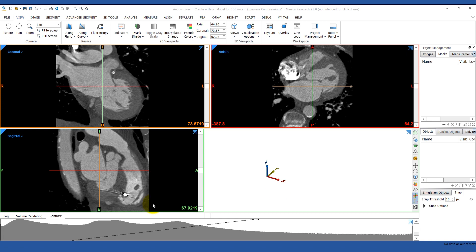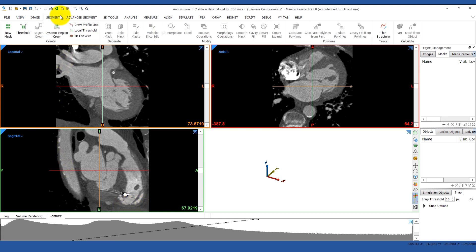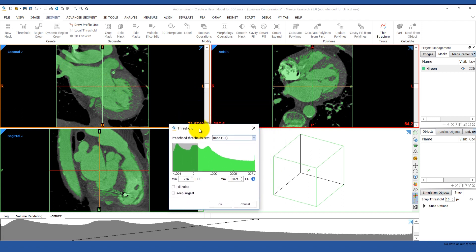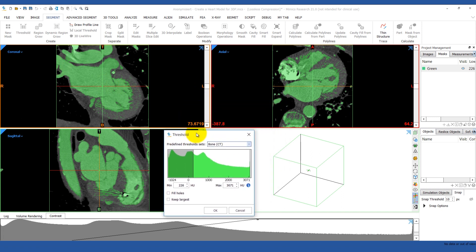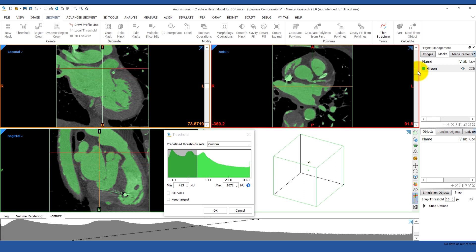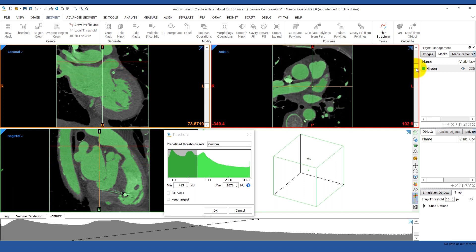To start the segmentation, go to the Segment tab and click on the Thresholding tool. Keep the upper boundary at the top. For the minimum value, we want a value where we can capture the blood but that doesn't allow it to bleed out and connect structures that aren't actually connected. Scroll through your images to make sure they're accurate.